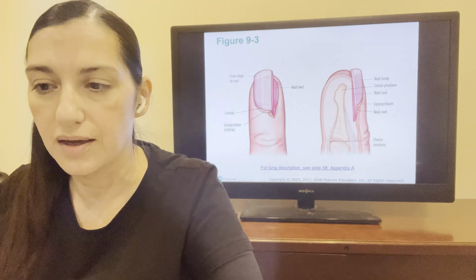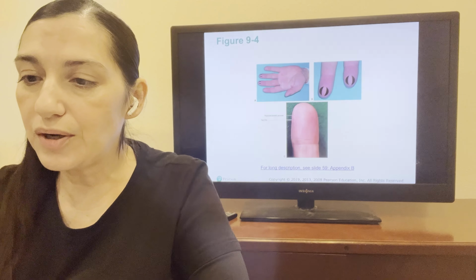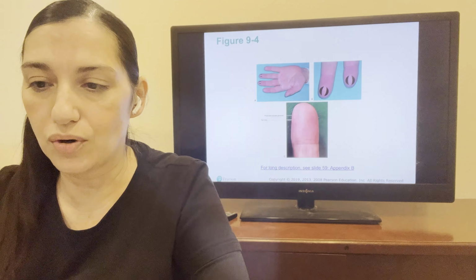Sites for dermal puncture on the fingers, the finger stick. In figure A, the third and fourth finger of the non-dominant hand is the preferred choice. In figure B, note that the darkened areas or curved areas represent the most suitable puncture sites that avoid the risk of puncturing the bone or nail bed. Keep in mind that each patient is different and slight adjustments may be required.